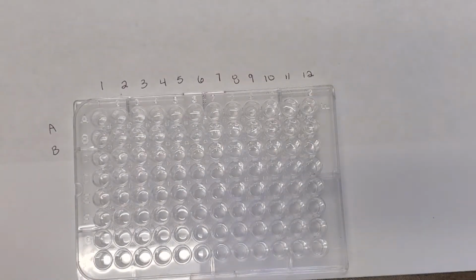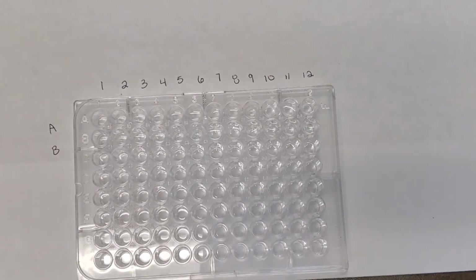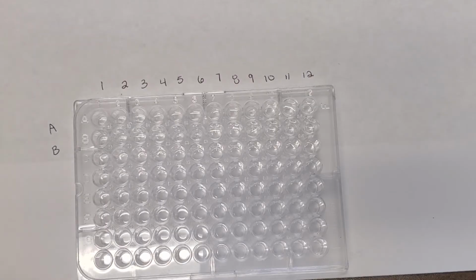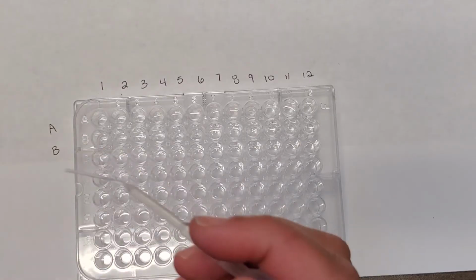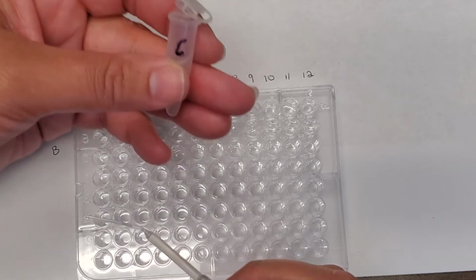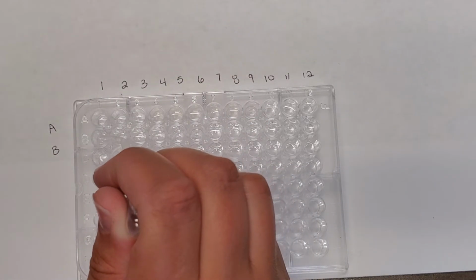So again, the patient serum is basically simulating the patient's plasma. We're testing their plasma to see if the antibody is present. These patients may or may not have the antibody, and that's what we are adding right now. And then we're going to test that further. So now I'm looking at patient C here. Patient C is our third patient, and that's going to go into wells B1 through 3.